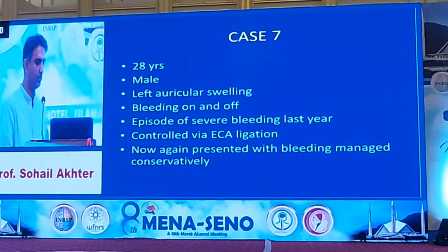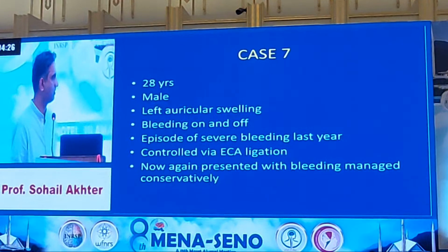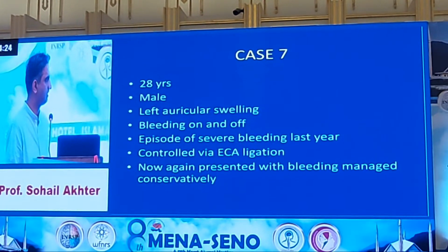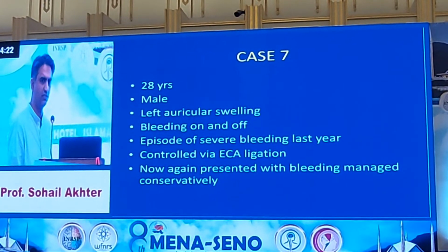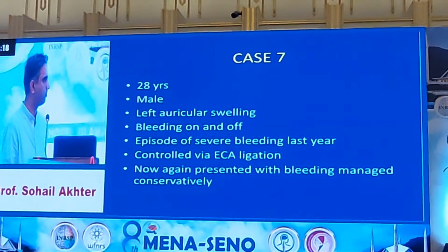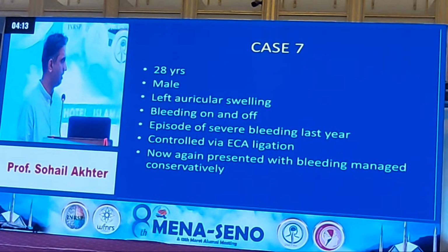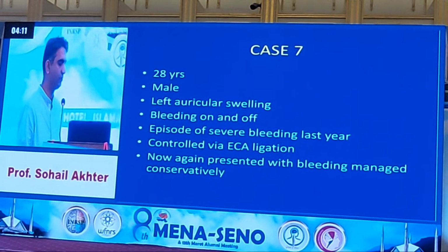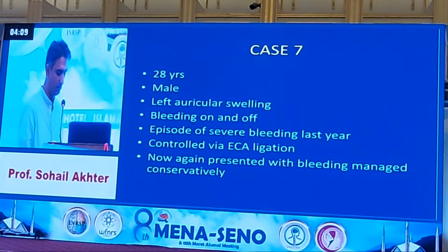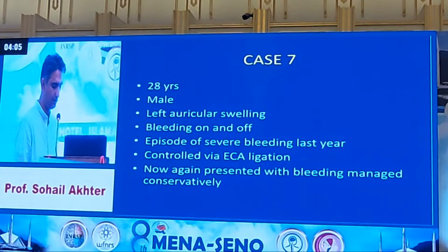Now coming to case number 7, it's an interesting case. A 28-year-old male, left auricular swelling, again presented with skin ulceration, bleeding off and on, non-healing ulcers for 1 year. He had an episode of severe bleeding last year, and it was controlled by ECA ligation. And now he has again presented with bleeding, which was managed conservatively. But now the clinician, a vascular surgeon, asked for endovascular treatment of this case.